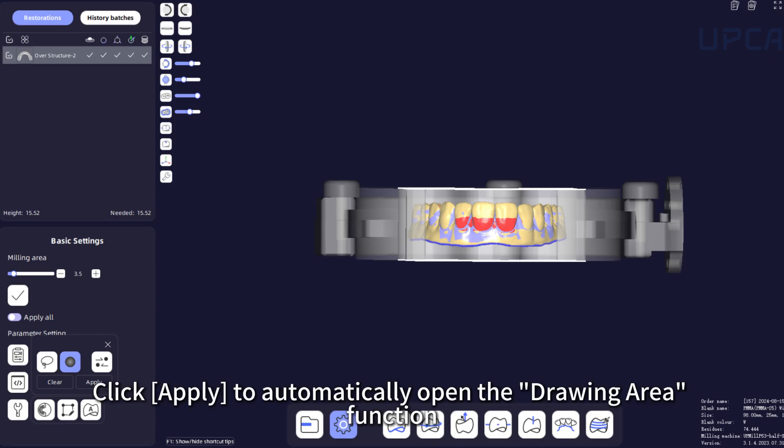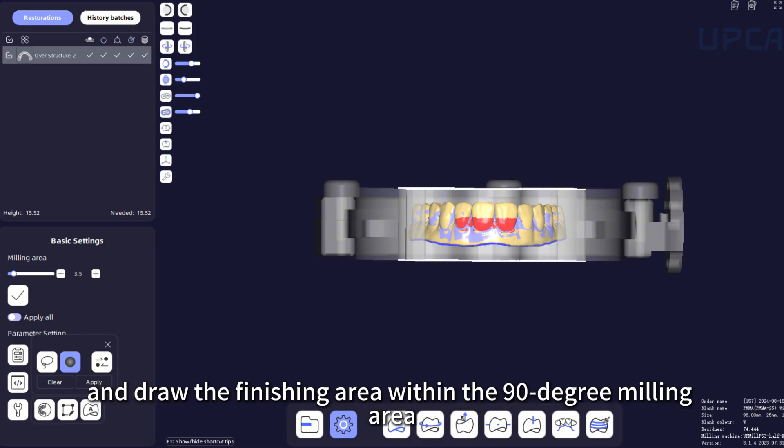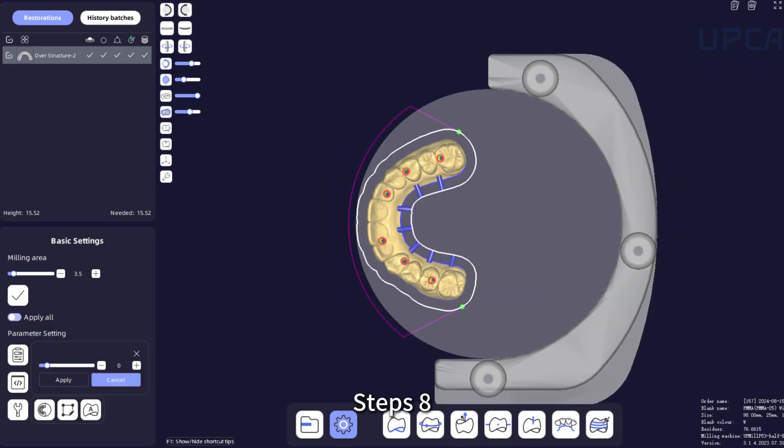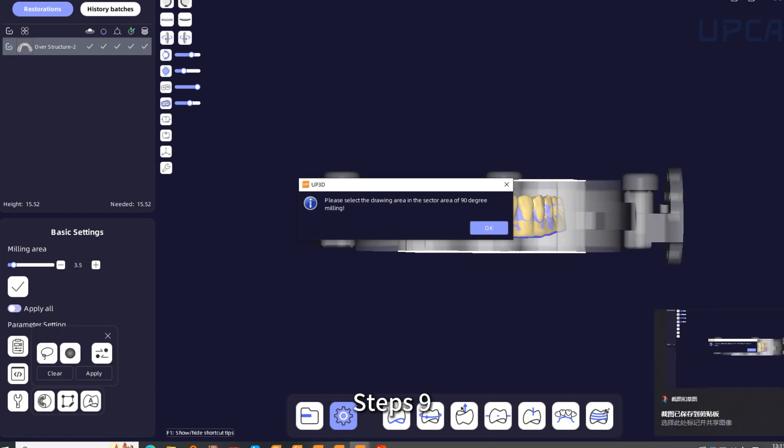Step 7: Click Apply to automatically open the Drawing Area function, enter the Drawing Area page, and draw the finishing area within the 90-degree milling area. Step 8: Click Cancel to close the 90-degree milling area and return to normal milling.